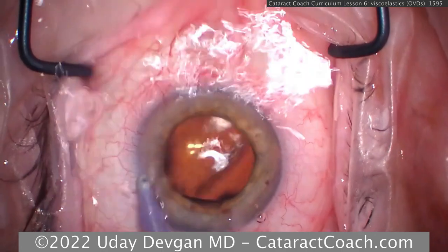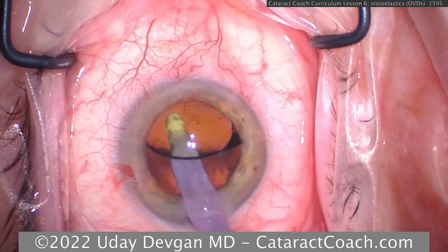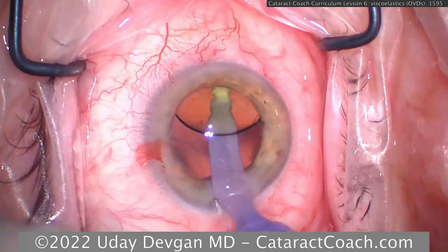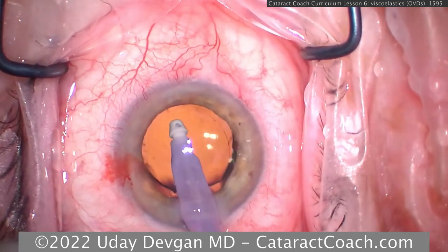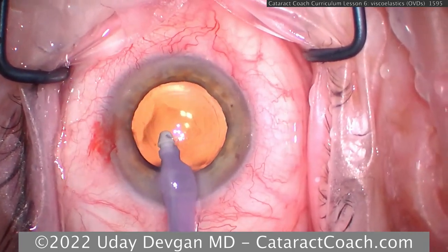Let's look at another one. Time to go under the IOL and remove viscoelastic, and again, you see there are diffractive rings. So the main reason we're avoiding leaving viscoelastic in the eye is that it's going to allow that IOL to shift. So if we really are careful to remove all the viscoelastic from the back surface of the IOL, from the posterior capsular surface, that'll allow the IOL optic to stick into position.